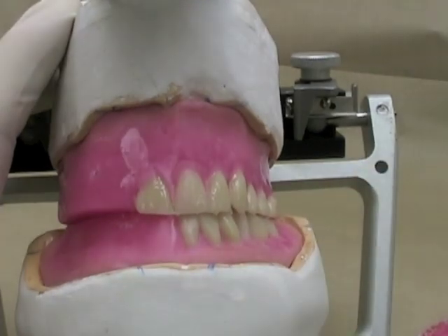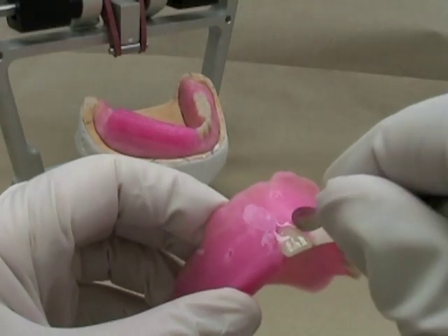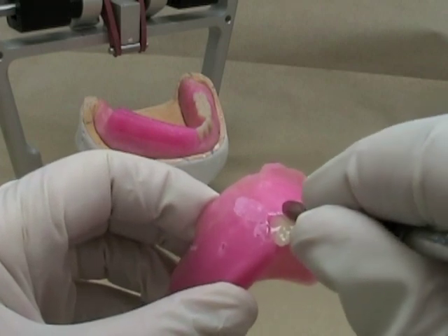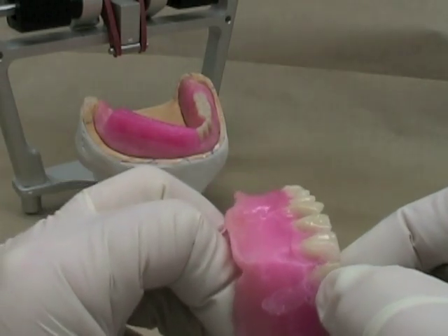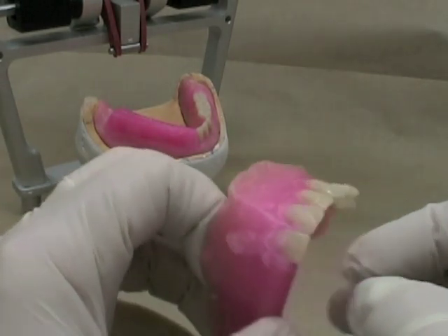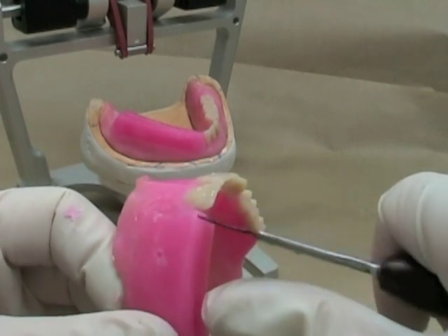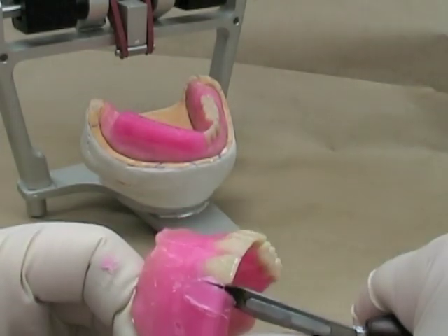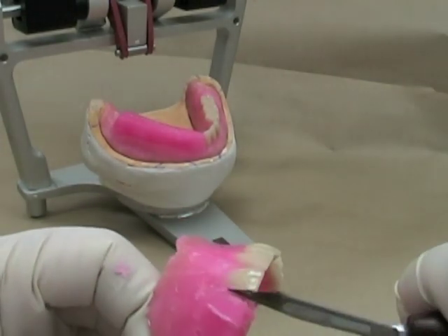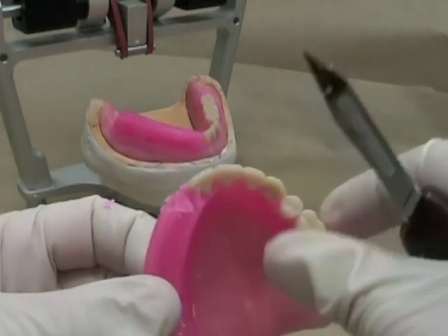Watch that your incisal edges are relatively flat and make sure that you don't end up with a diastema. I've got the tooth close to where I want it — I'm just going to soften up the wax a little bit more, move it closer to the other central incisor, and straighten up the incisal edge. Remember, as you're removing the wax always use your finger rest so that you don't have a mishap and poke yourself with a sharp instrument.